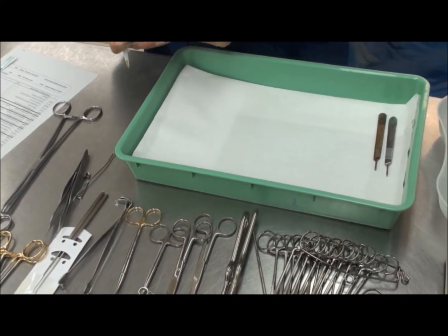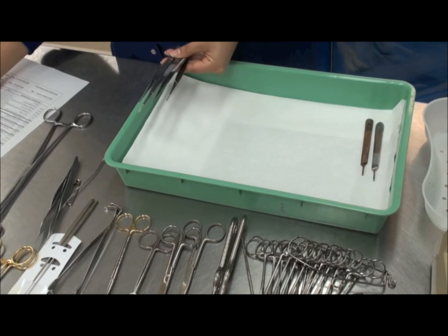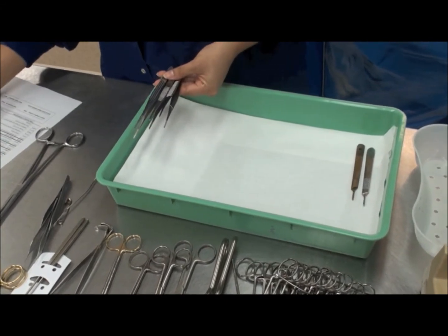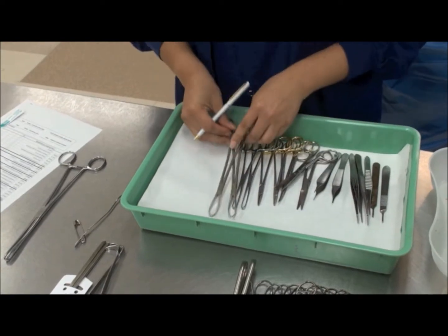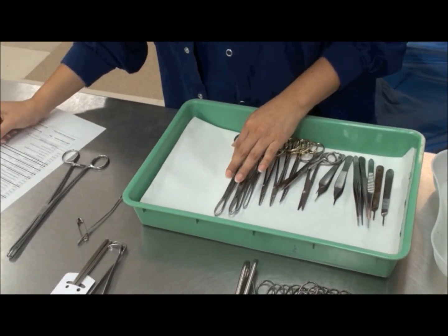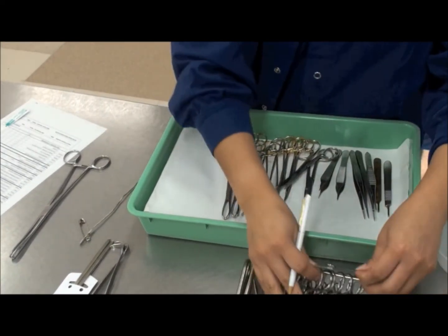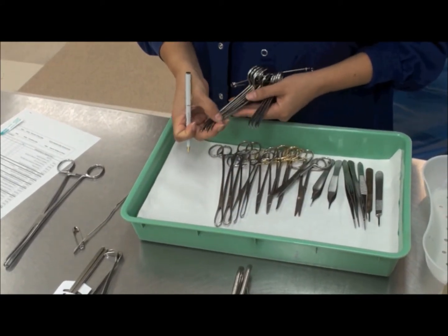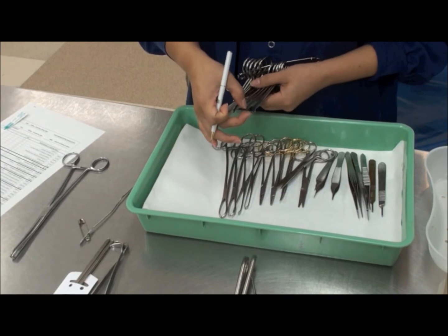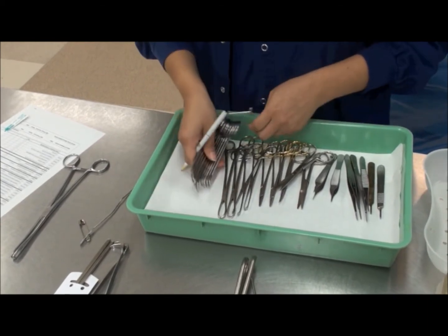At the same time, the technician is checking that surgical instruments are clean, intact, and functioning, and are accounted for as per the traylist. Multiple instruments such as towel clamps and artery forceps are placed on instrument pins in an open position.